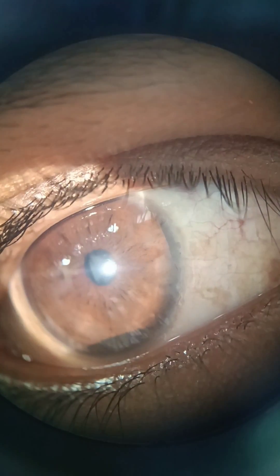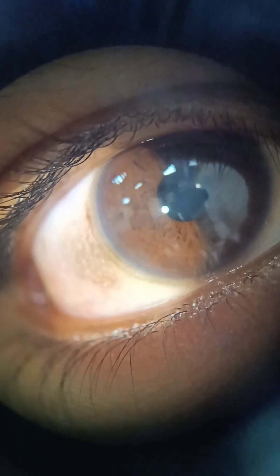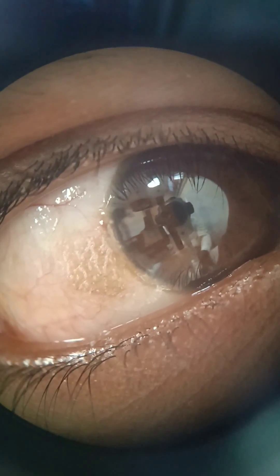There were noticed peculiar type of lesions on the temporal aspect of both eyes. As you are seeing in the video, there is a triangular patch which appears dry, greasy, and foamy, located temporal to the limbus.